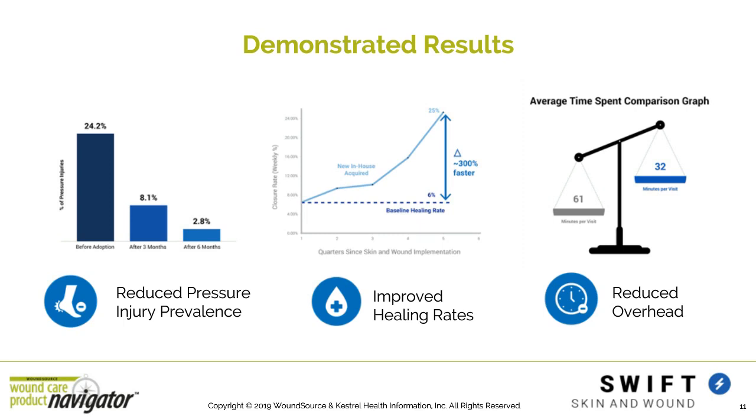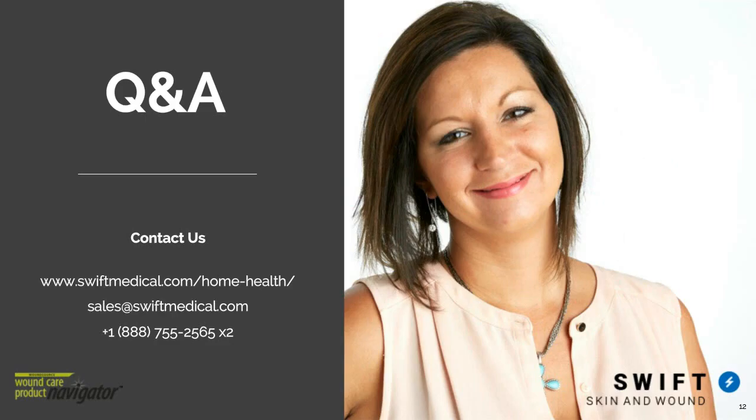In another study that we did, it's actually reducing the healing times that we see on stage 2. And then the average time spent to reduce that burden on the overhead for your management or back office running a QA analysis. So with that, I'm over to a Q&A, and I'll turn it back over to Emmy.